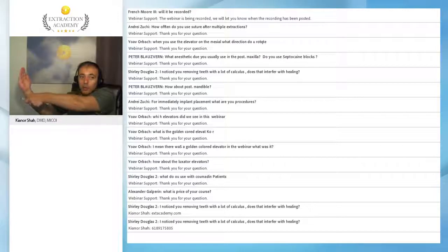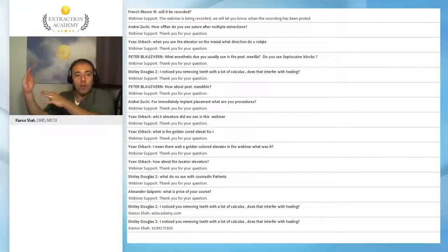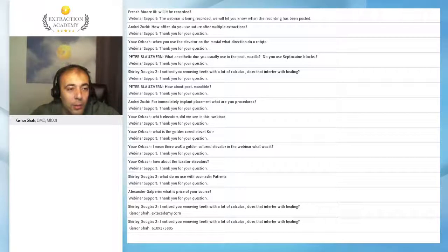You're rotating away from the adjacent tooth while engaging as much of the mesial as you can, but you have to stop at a certain point because you have to take into consideration that the molar has a distal root that could fracture if you go too fast or too far. And then you come to the buccal and put your elevator in the buccal and see if you can get a purchasing point there. And then you do another twisting motion, whichever direction you want, in order to get more of the elevation or the pop motion. And then you can go back to it with your forceps.